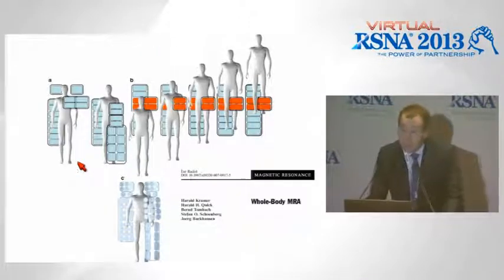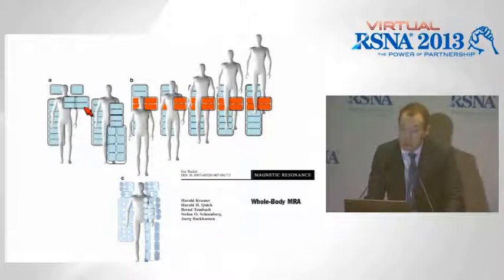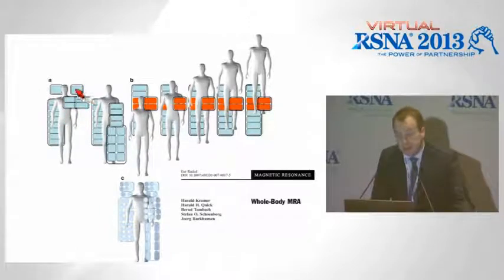There are different approaches, and I would like to point your attention to this nice review article. It's ideal to have a system with multi-channel equipment, which is true for most of the vendors these days. You can use the coils for the top of the body, do the selective injection here for the carotids, and then for the remaining vasculature switch the coils and do a run-off study.